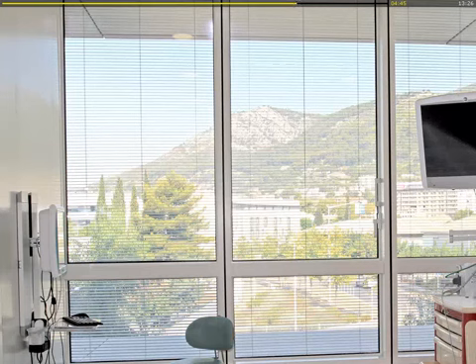mode. And then, now the regulation of the minute volume is no more based on the end-tidal CO2, but on the patient respiratory rate. Meaning that if the patient respiratory rate is very high, the target minute volume increases in order to increase pressure support. And reversely, if the respiratory rate of the patient would be low, this would decrease the target minute volume in order to decrease pressure support.